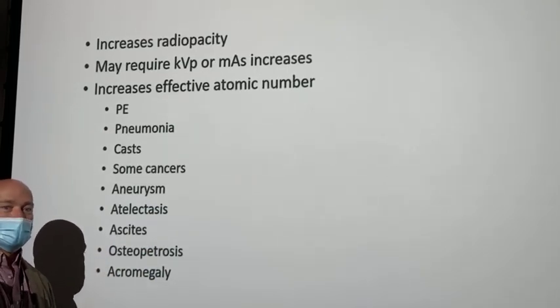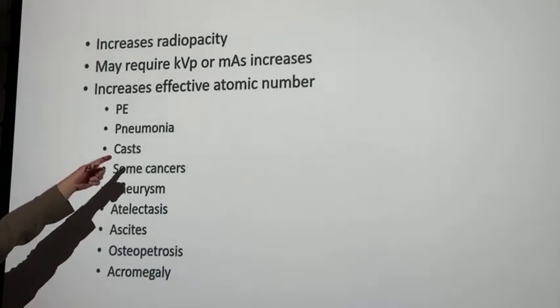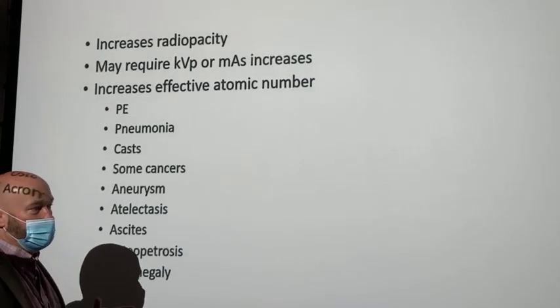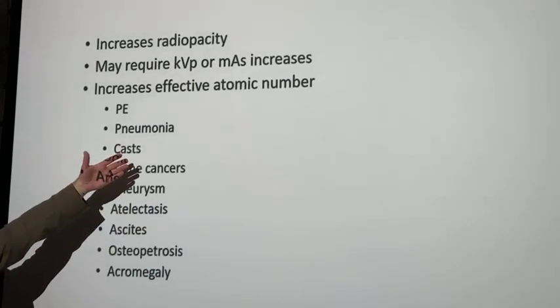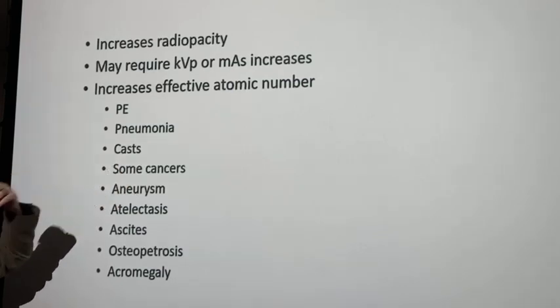A puncture, pneumothorax, right. Pneumothorax is not additive, it's destructive. So what are you looking for on the pneumothorax? If it's a 10% pneumothorax, which is very small, it's going to be difficult to visualize, and if you increase your technique because you're thinking the patient's got atelectasis, you might burn out the pneumothorax and not see it.